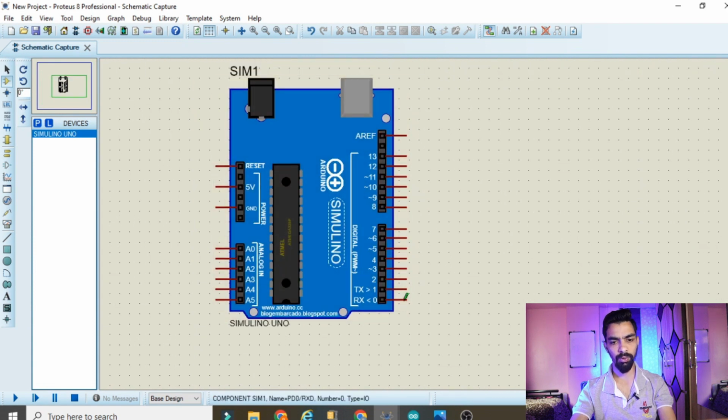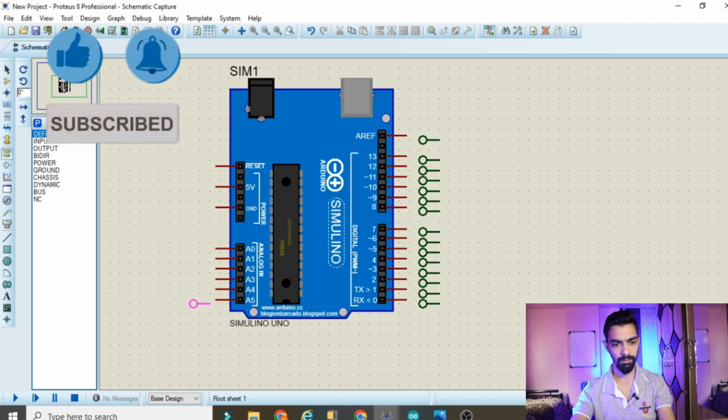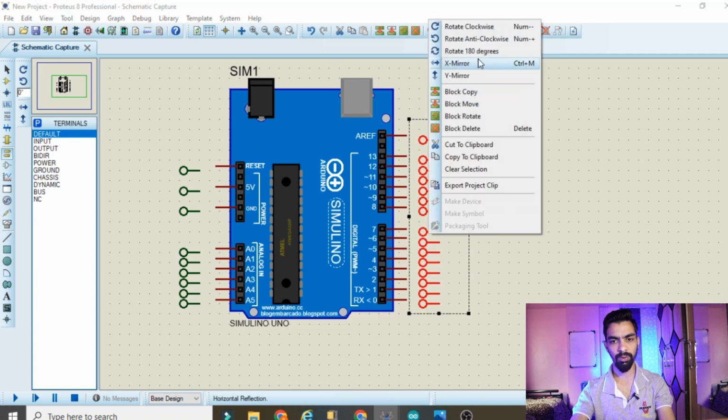Okay, once you place the Arduino Uno, we have to give some default pins here. So go to the terminal mode, then click on default. Once you click on default pin, place default pins one by one in front of each pin. You can see I am placing them one by one in front of each pin here. After that, you can select all these pins at a time, right click and rotate 180 degrees.